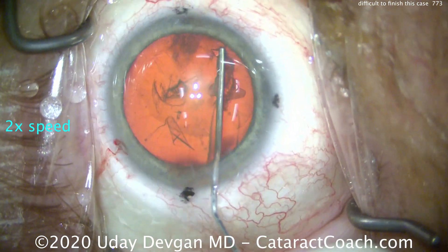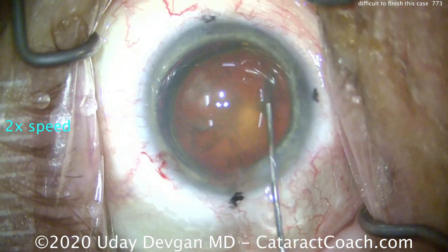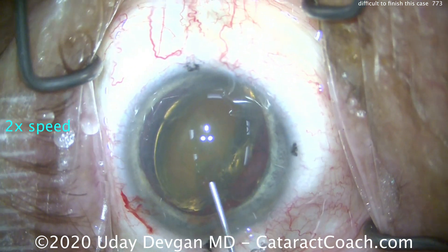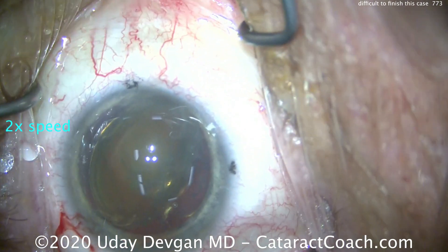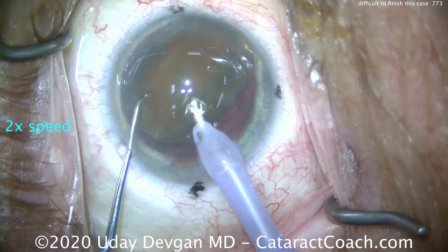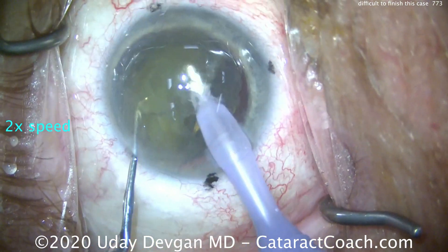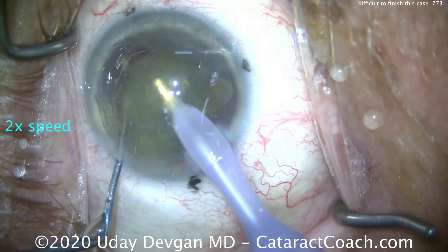A little bit of hydrodissection. I'll see a few fluid waves going across — that looks good. There's our nucleus. It prolapses partially out of the bag — we'll take it, no big deal. More dispersive viscoelastic to protect the cornea. Phaco probe going in the eye. We're going to use our chopper and chop, chop, chop this nucleus. Nucleus is chopped in half, and each half is then emulsified. So you're still wondering, where's the challenge?